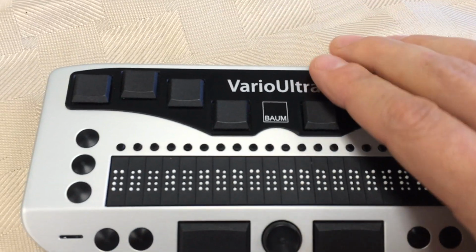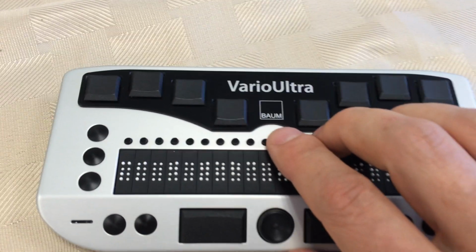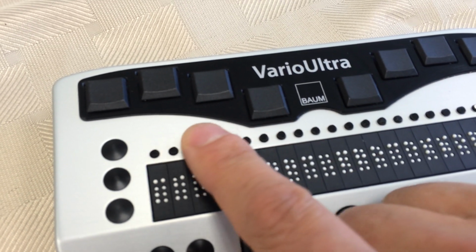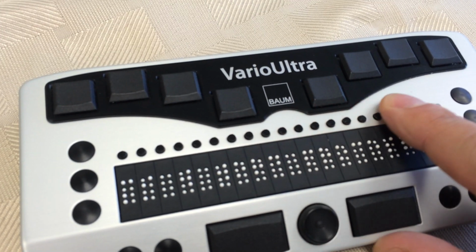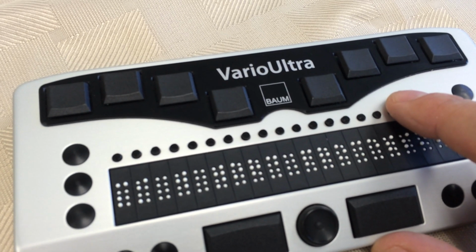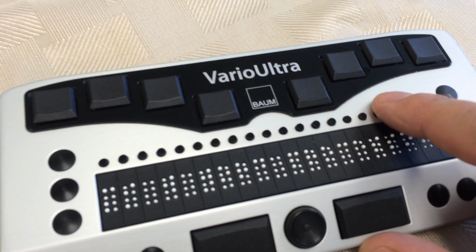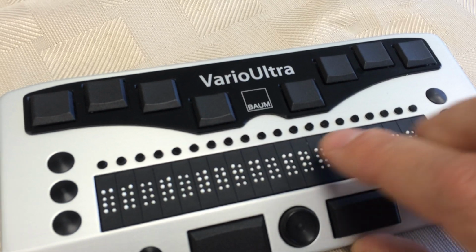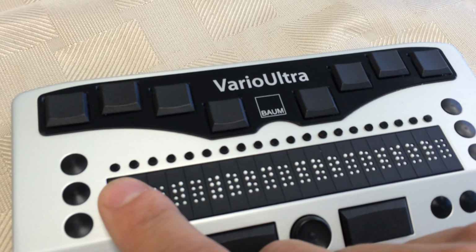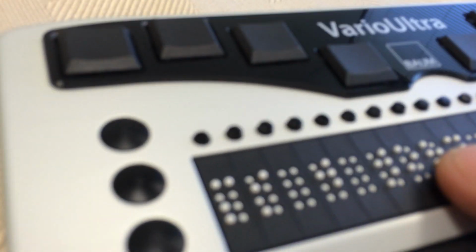Below the keys, if I bring my fingers towards me, so again, this is the 20-cell display, what I feel is a row of raised dots. These are certainly bigger than Braille dots, and they are the cursor routing buttons that we can use to move to a position on the Braille display itself. Speaking of the Braille display, right below the cursor routing, that's where we have the Braille cells.